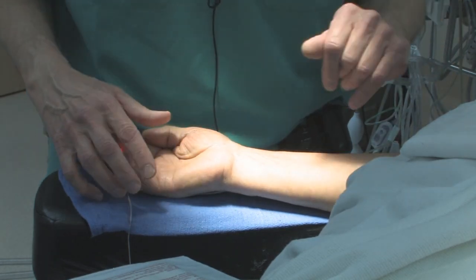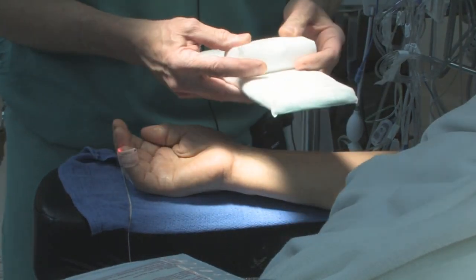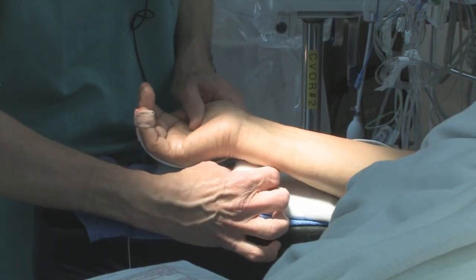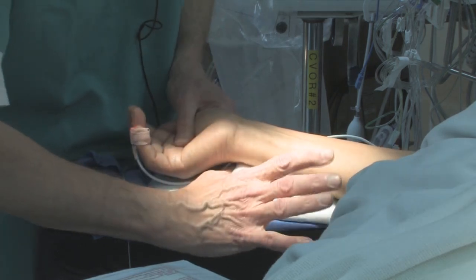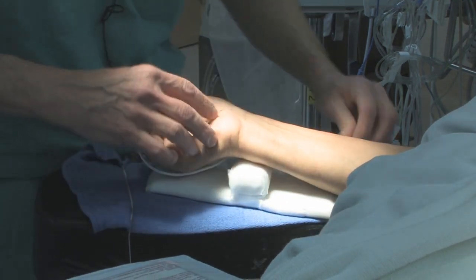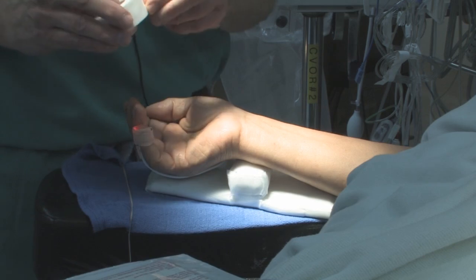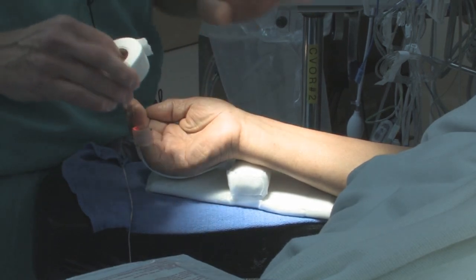Some people will still pronate, but I'll show you what I do to minimize that. When you make an armboard, get a decent roll and put it in the middle. You want to roll one finger breadth below the crease — not here, not here, not off to one side. I use my thumb to measure — that's one finger breadth below. I also put the oximeter inside so it doesn't pull away.